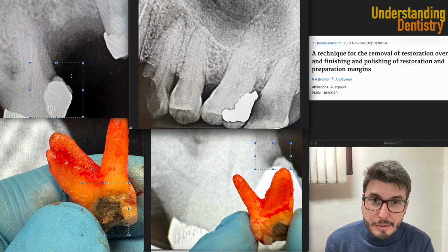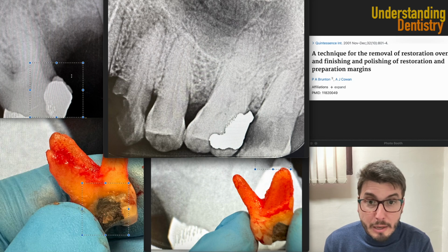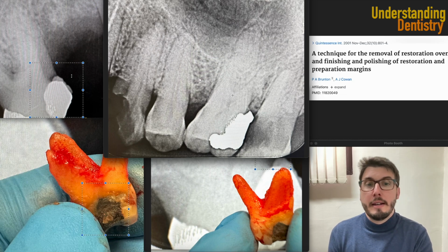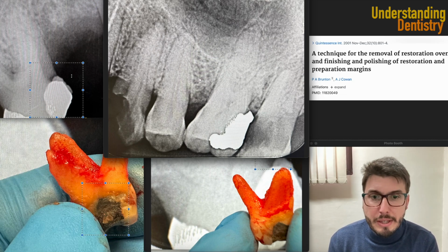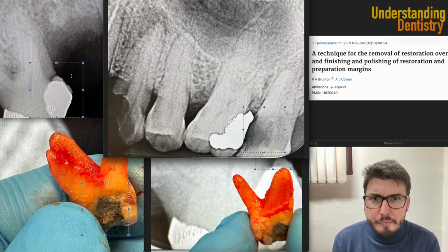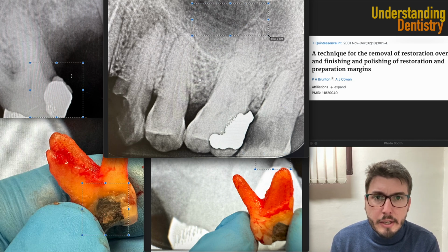So take a look at this. Let's increase now the size of this other radiograph. Now the overhangs are even in continuation with the alveolar crest, so with the level of the bone. So that's the level of the bone, and the restoration is even in continuation, we say radiographically, with the bone. Now of course we have recurrent caries here, even opacification of the maxillary sinus, and we can even see the nutrient canals here. So this radiolucent line here is the nutrient canals of the sinus.